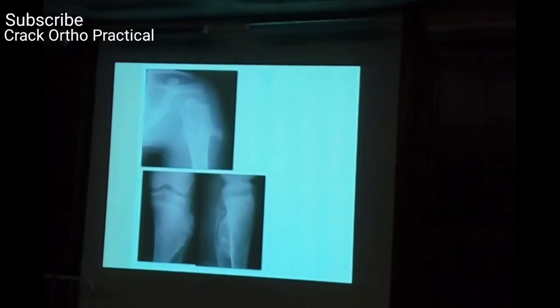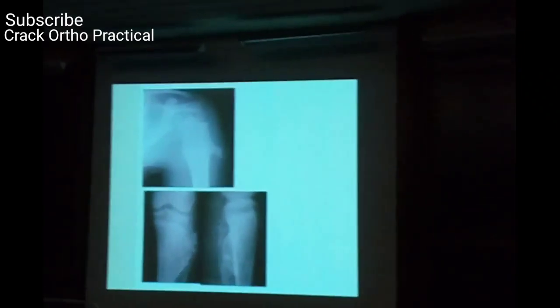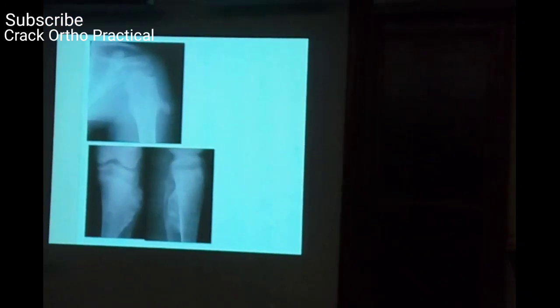Who is there next? X-ray of the patient is different.